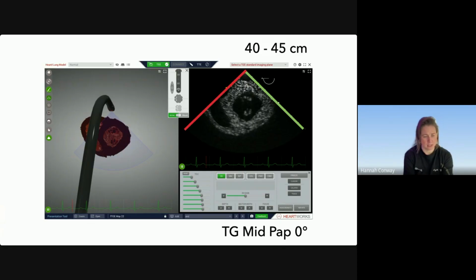So the important thing is to make sure that you've taken off all of your degrees and that you've taken off any flexion of your probe, even though this appears like there's flexion here. This will be the position in which your flex will look when you're looking through the ventricle. But as you're advancing to this view, you need to make sure that your probe is completely straight, and then advance without force.